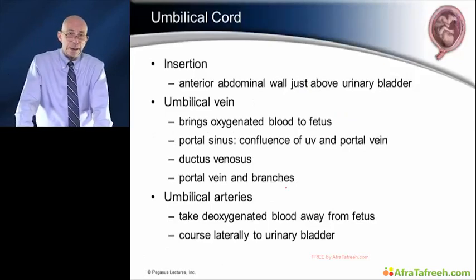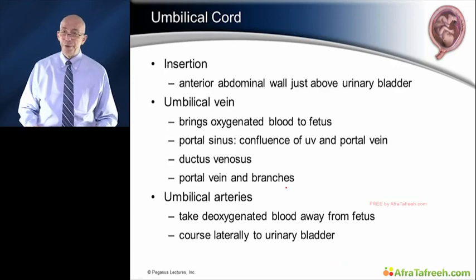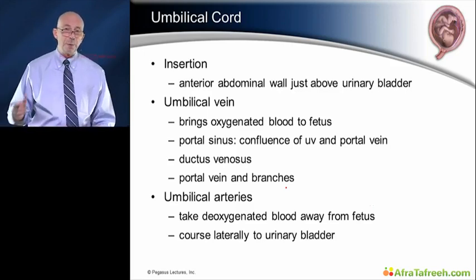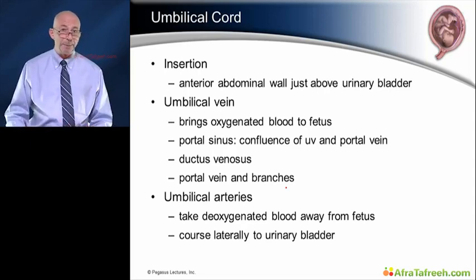The umbilical cord inserts on the anterior aspect of the fetal abdomen just above the urinary bladder. It's lower than our belly buttons, and in evaluating the fetus, it's important to remember that it would be found just above the urinary bladder, not in the mid-abdomen.